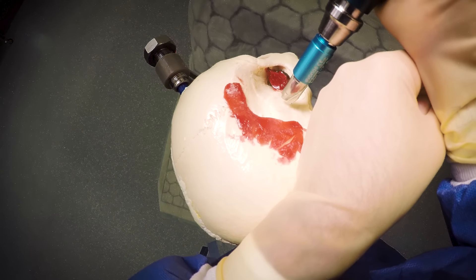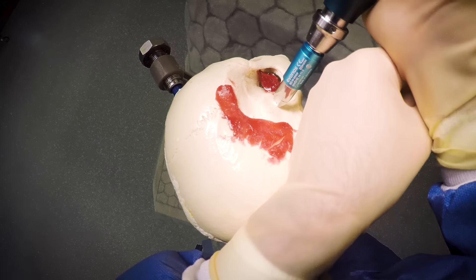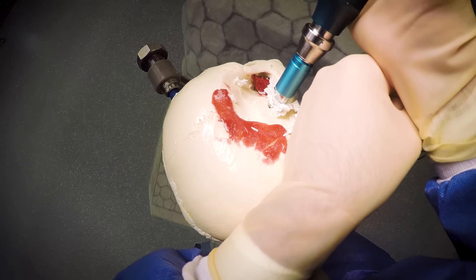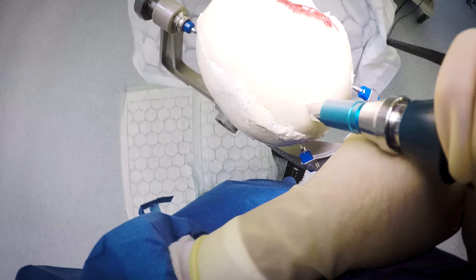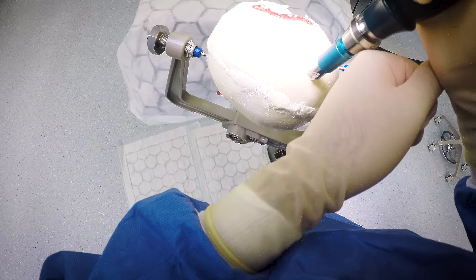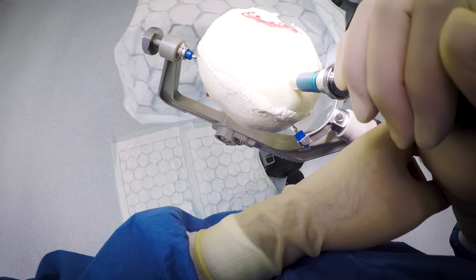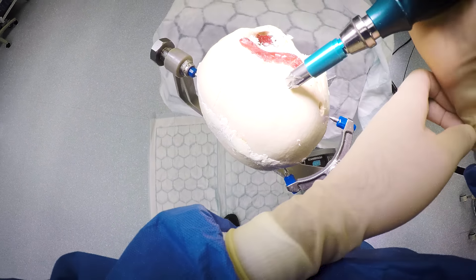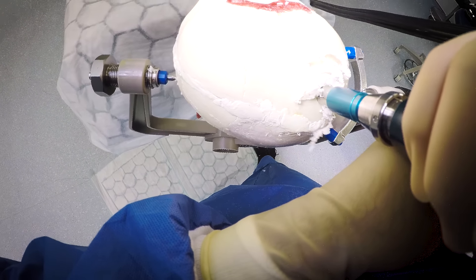When you're drilling, there's a clutch system that detects pressure changes in the drill bits, meaning you shouldn't plunge directly into the brain. Should it fail — which is really unlikely — your other hand is going to stop that drill from plunging into the brain. You need to make sure before you start that you are perpendicular to the bone, not angled off in one direction or another. Otherwise the burr hole won't be adequate and you won't be able to get your craniotome underneath. So take a bit of time and make sure that your burr hole is just right.